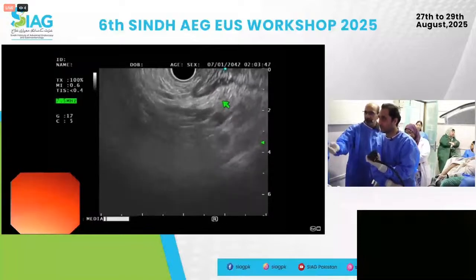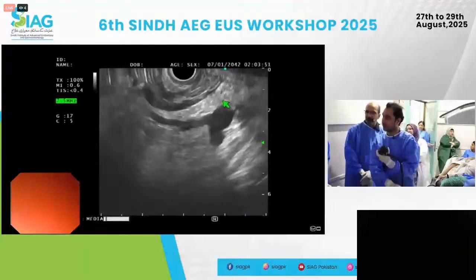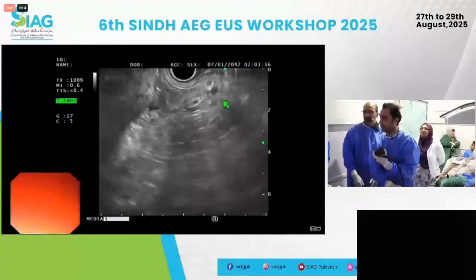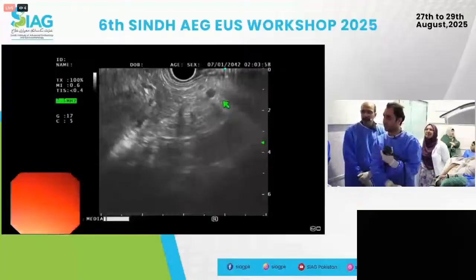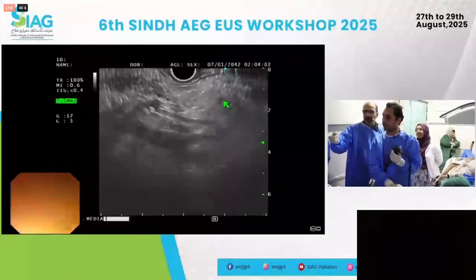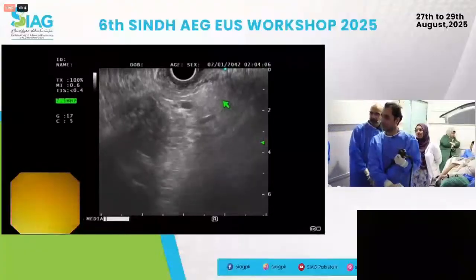Okay, here we fell back into the stomach, so now you usually have to go counter here. Get back to. Now go clockwise again. I'll go all the way counterclockwise. So you have to kind of do a clockwise or counter depending on where you end up with the fallback. But your pancreas is going to be up here, right? So keep going counter and pull back.